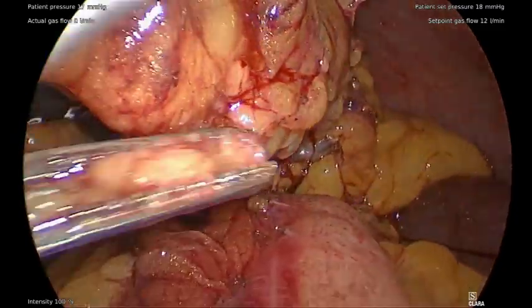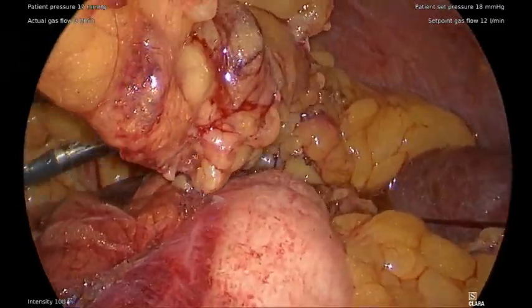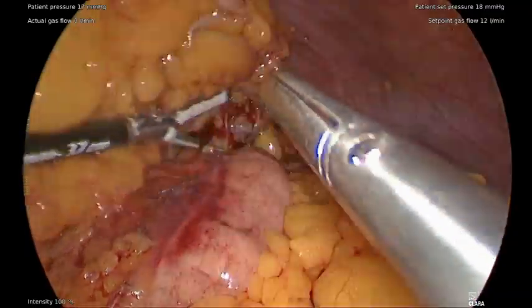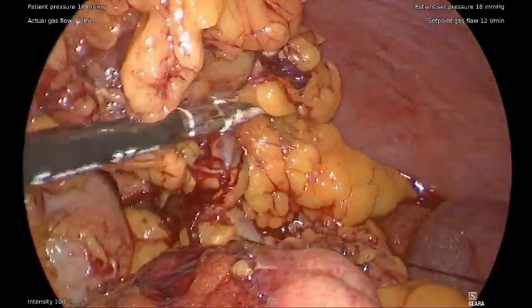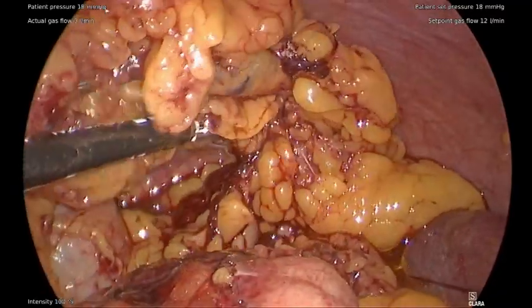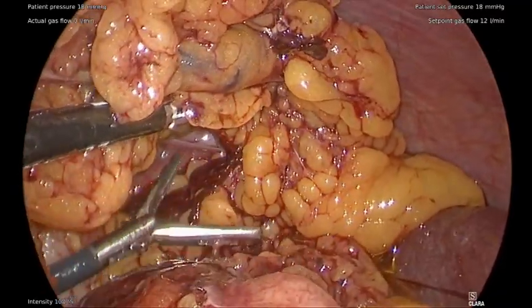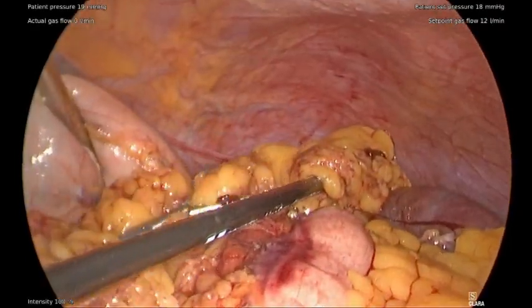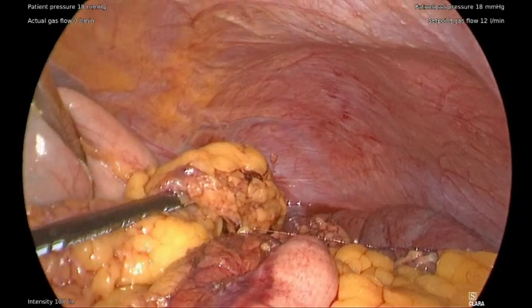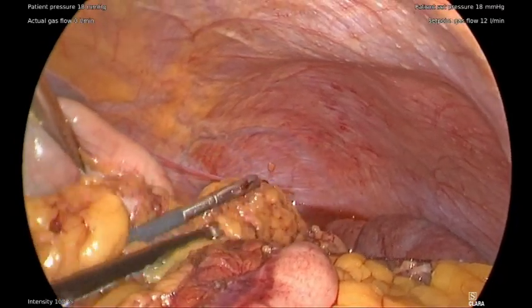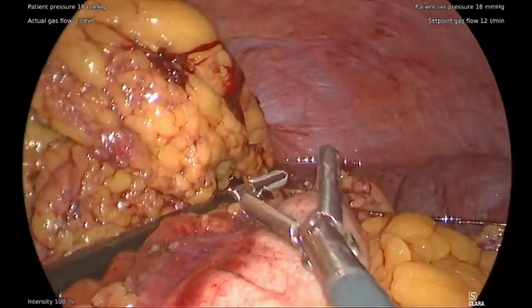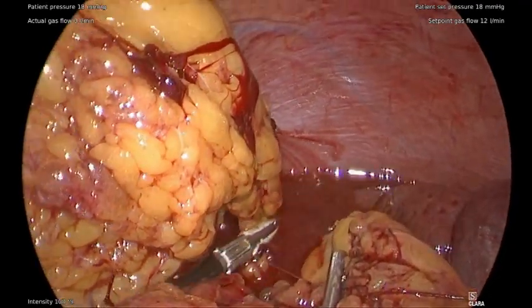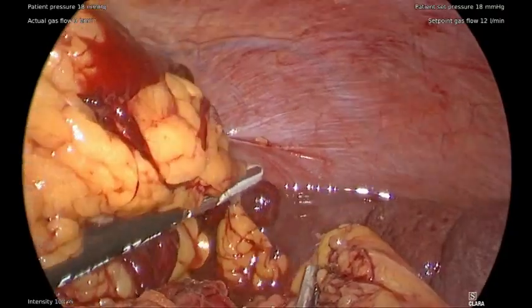In order to better visualize the remaining attachments, the flap can be mobilized towards the hepatic flexure of the colon. Here we can see the completion of that dissection.